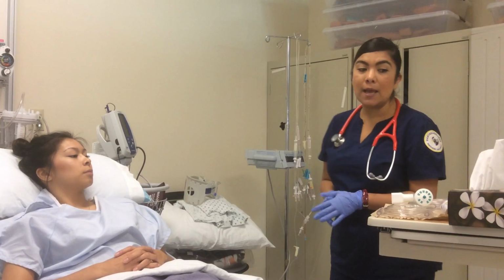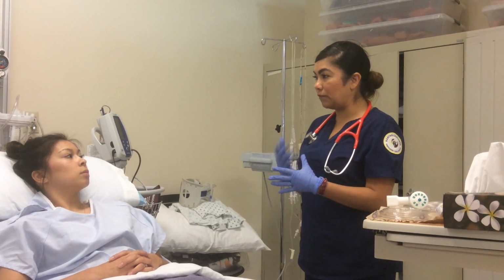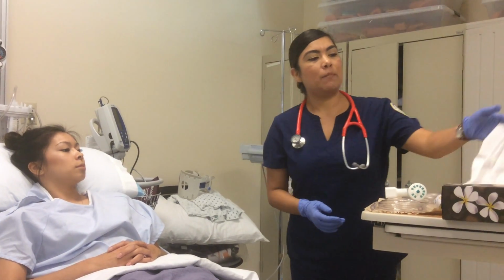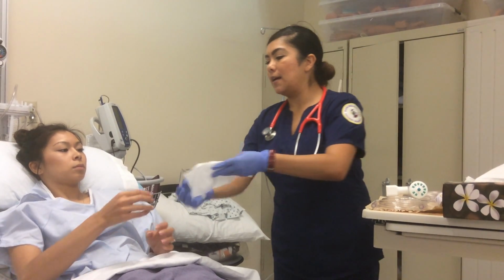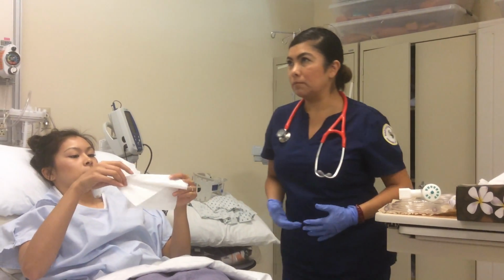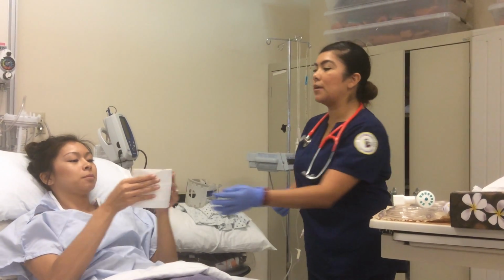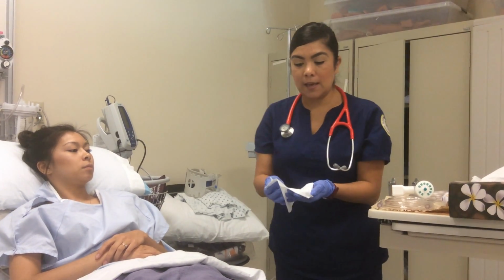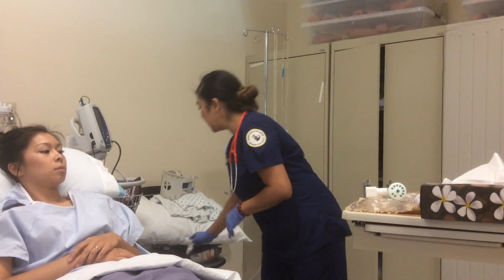Okay, perfect. I do also need to see if I could get a sample of your cough. Is that something you could do right now? Okay, I'm going to provide you with Kleenex. If you could just go ahead and cough into this Kleenex, a strong cough, and you want to just inhale in and then there. Very good. Okay, perfect. Do you feel okay? Okay, thank you. So I'm just going to look, and it looks nice and clear, so that's good. I want you to go ahead and discard of that.